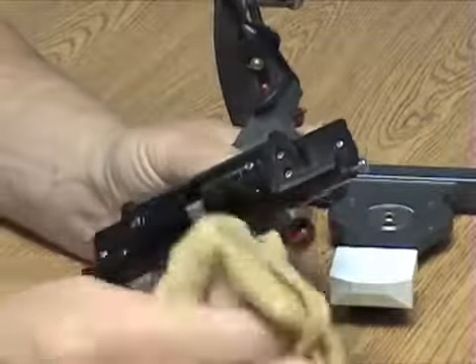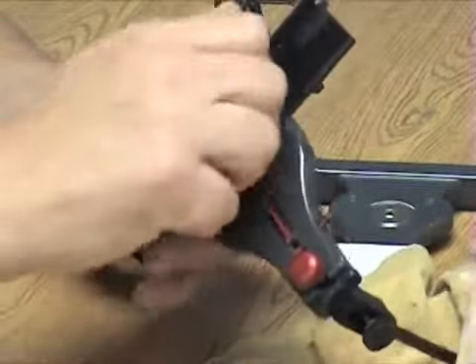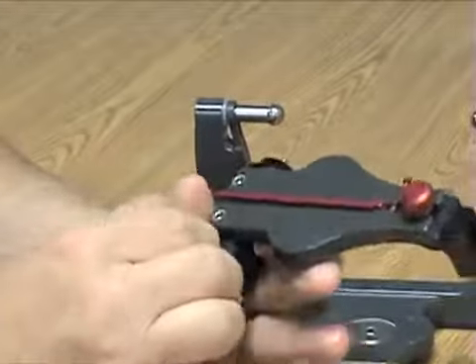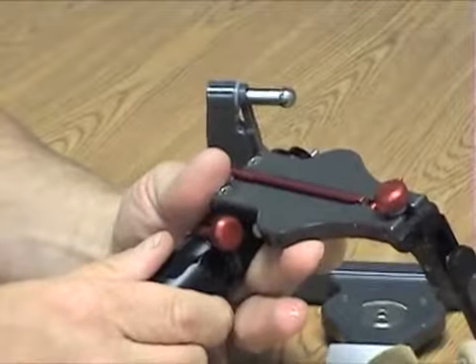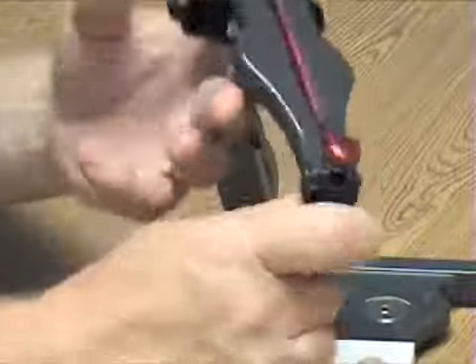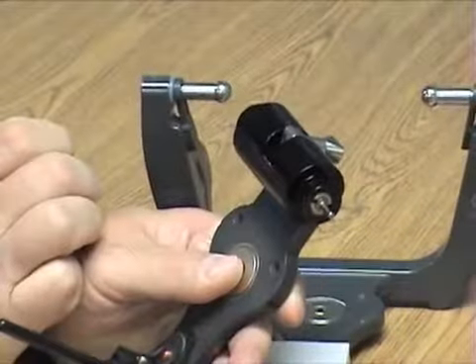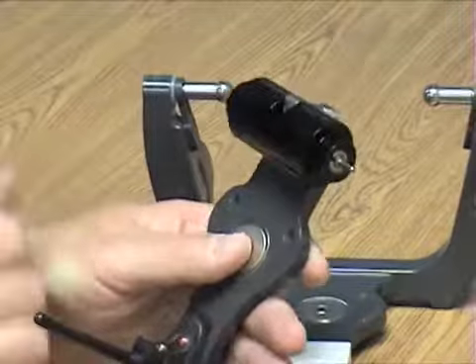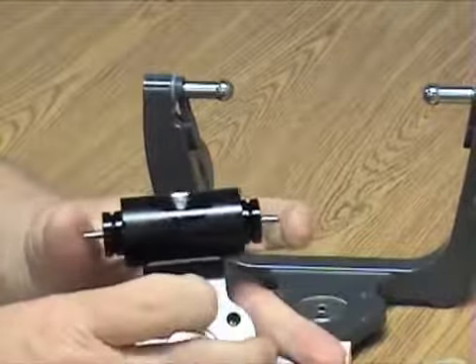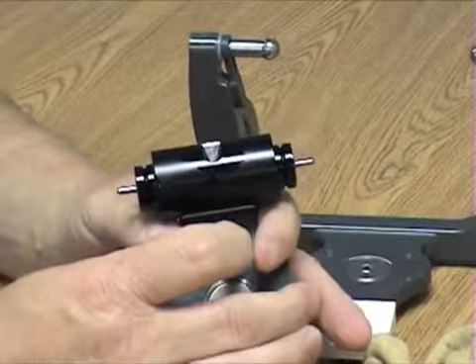Today I'm working with the 320, and the 320, like the 330, as we mentioned in earlier videos, has removable fossas. We simply rotate the fossa to where the knob is forward, and the fossa comes right off. That opens up the back side of our latching mechanism so we can see how it's functioning. It allows us to see that the centric pins need to work freely and move back and forth in order to function properly.